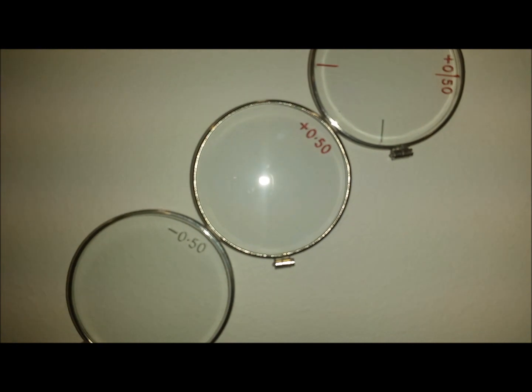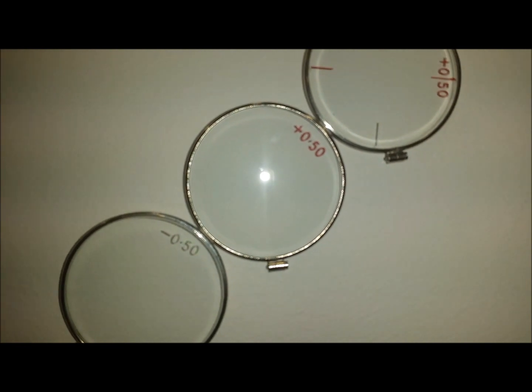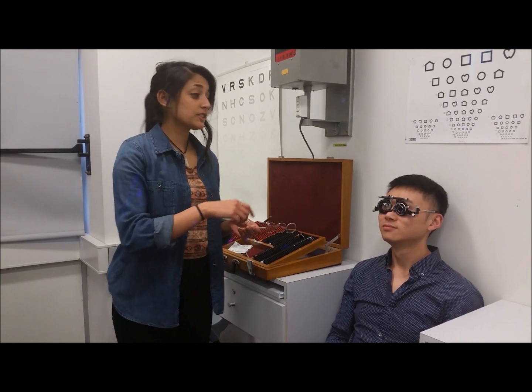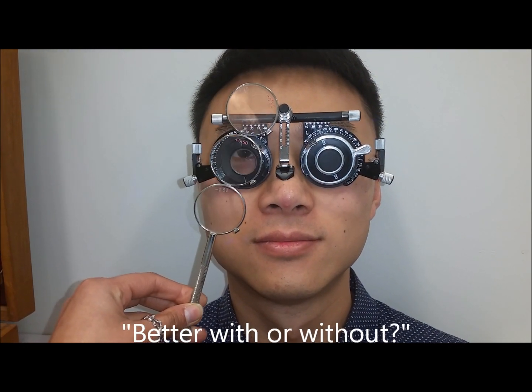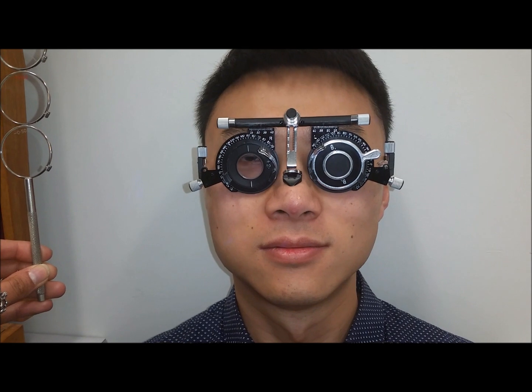Using the plus 0.5 dioptre sphere lens on the confirmation set, hold the lens centrally in front of the patient's right eye, asking them if the letter is clearer with or without the lens. Okay, Hongbin, I'm just going to get you to look up at the letter A for me there. And I'm just going to get you to tell me whether it's better with or without the lens. Without the lens.